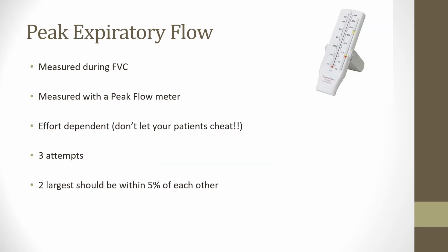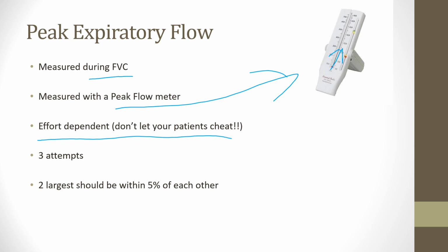When we're looking at something where we know it's just obstructive disorders, we can do something as simple as a peak flow device to measure their peak flows on a daily basis. This is something that we can get during a forced vital capacity on the machine. It'll give us a peak flow, or we can use a peak flow meter, right? These little guys over here, where they forcefully blast that breath into there, and it measures how fast their breath was. And this is a big thing, it's effort dependent on these patients. So if you can get the best effort out of them, you'll be doing well.